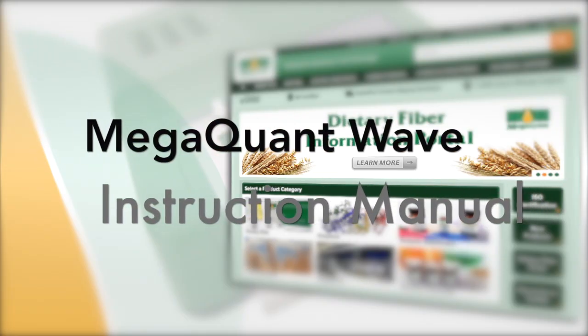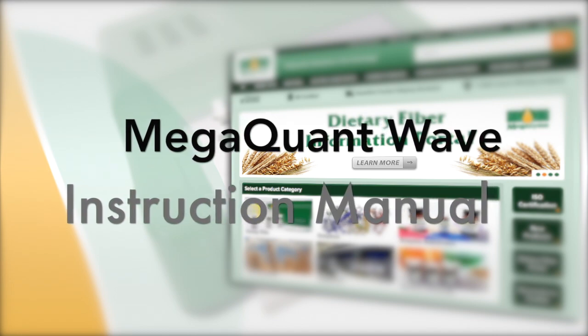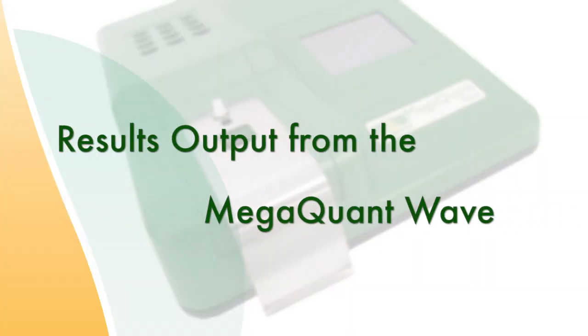The full specifications and features of the MegaQuant Wave are detailed in the user manual and other associated documents that are available to download from the Megazyme website.